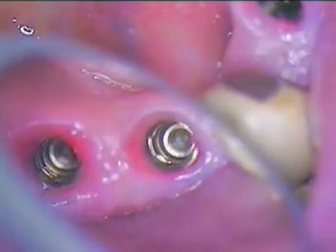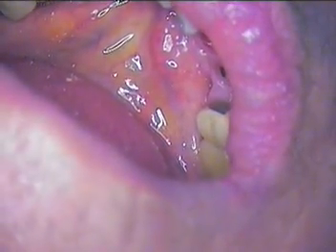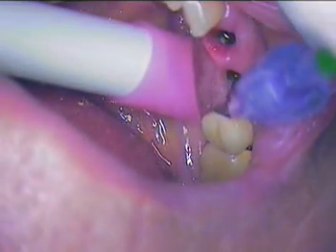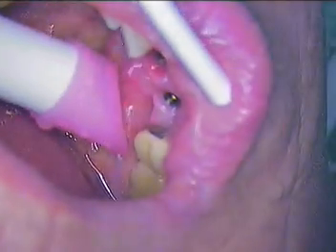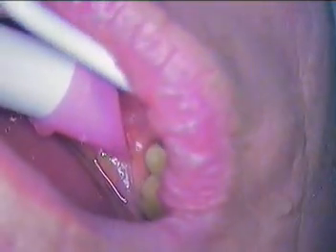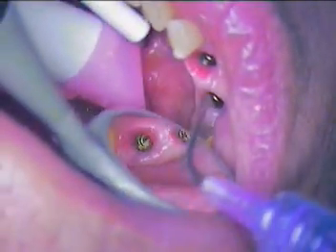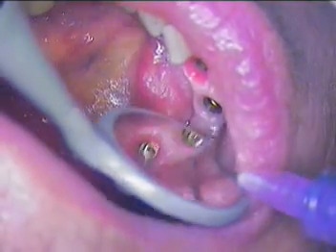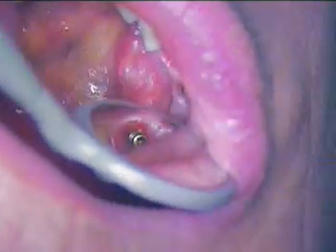Number 28 looks good, but number 27 needs a little bit more. We'll squirt some more water down there. I've got a leaky O-ring this morning, but I'm going to still use what I have. You can see how the syringe goes right down in place. That looks pretty good now — I'm now debris-free. It's a good time to put our impression copings in.